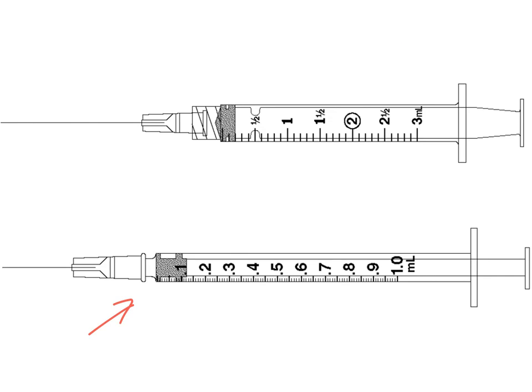And then here you can see another 3 milliliter syringe where, again, look at the distance between 1 and 2. We're seeing 9 lines in between. So here you'll see if I said to administer 2.3 milliliters, we'd go to the 2, and then 3 lines behind it would be right there. Again, you're going to see on your examples that the stopper will already be there for you. You just have to tell me how much medication is in that syringe.